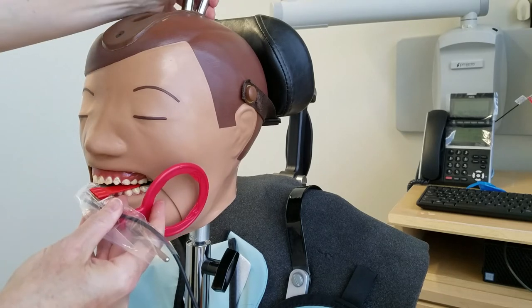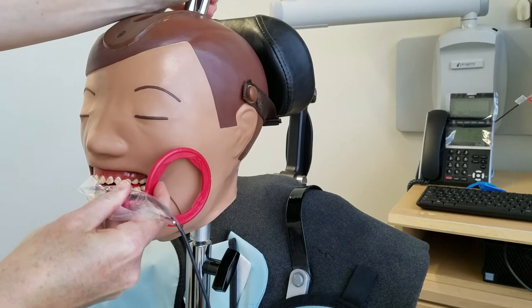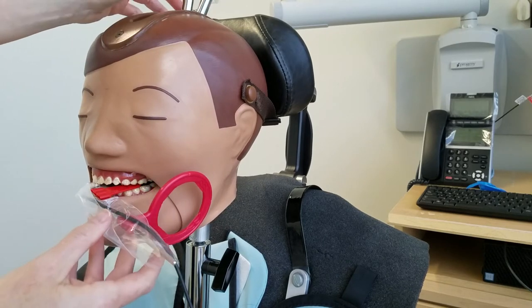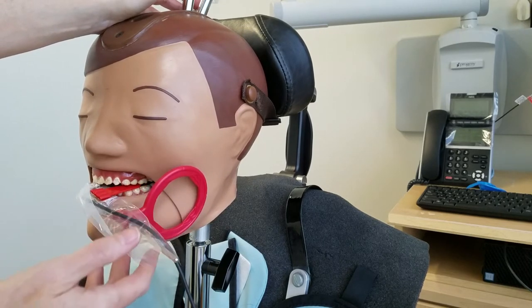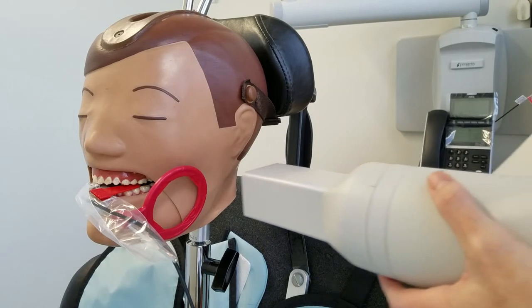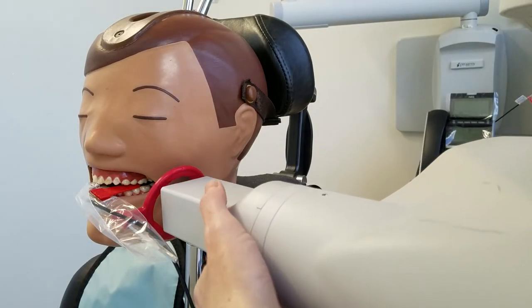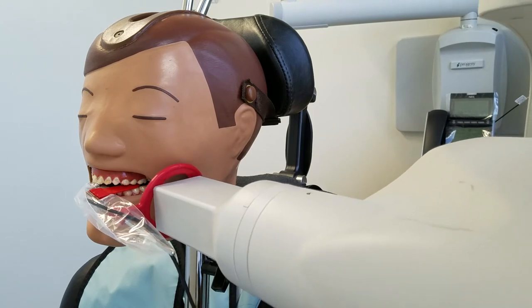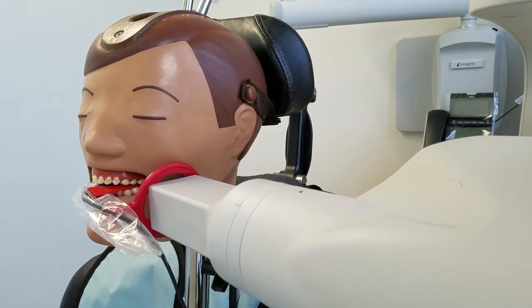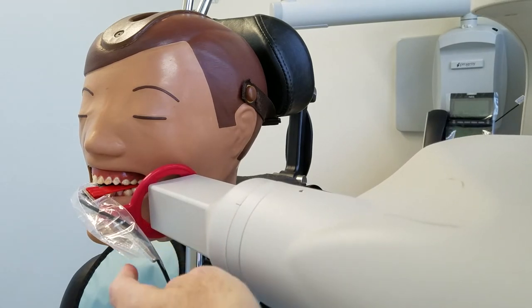This kind of slopes — we don't typically want it to slope with patients. See how it drops? We don't really like that because that's going to give us a placement error, but I'm just going to keep moving forward and bring this back at the same angle it was when I brought the Q-tip over.